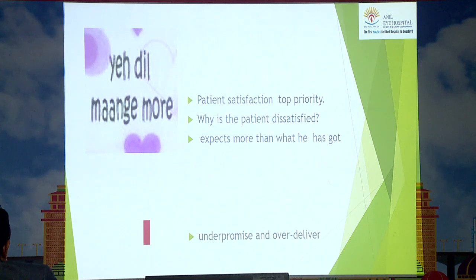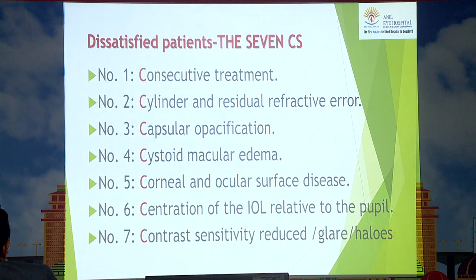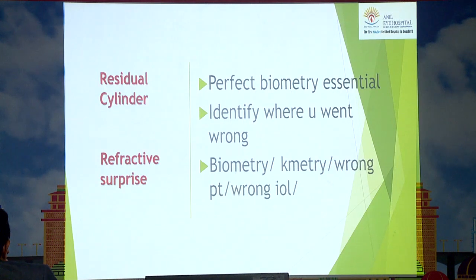Now, even though we know that we have done all that we can, if a patient is dissatisfied, then you need to know why. So these are the reasons why you would have a dissatisfied patient. So let's see just briefly. A perfect biometry is essential.